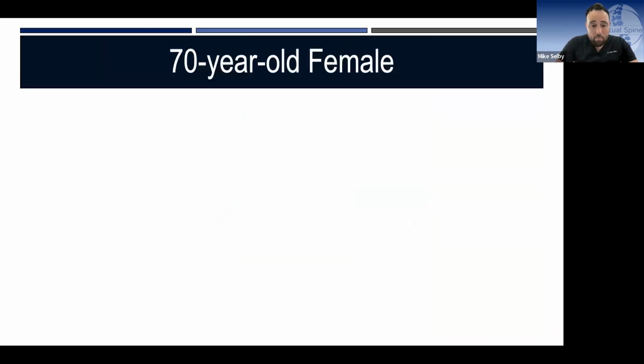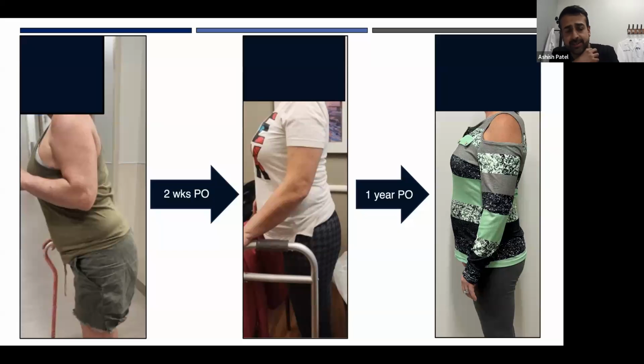Does her cord stim help with her paresthesias at all? I mean, it did. It actually did, yeah. Post-operatively she had a remote control for her cord stim, and it went missing for about a week, and she was dealing with it. And as soon as she found the remote control and applied it, she said it helped about 50%. There you go. That's why sometimes it's valuable to come in, right?